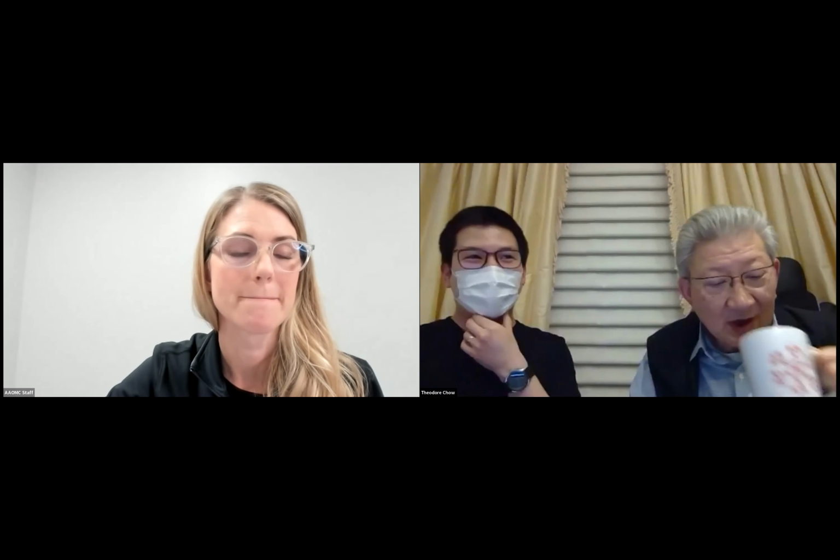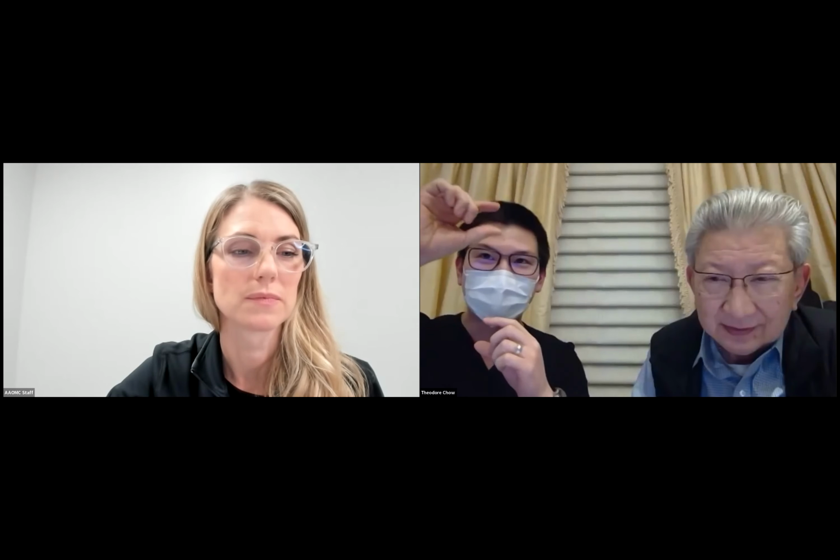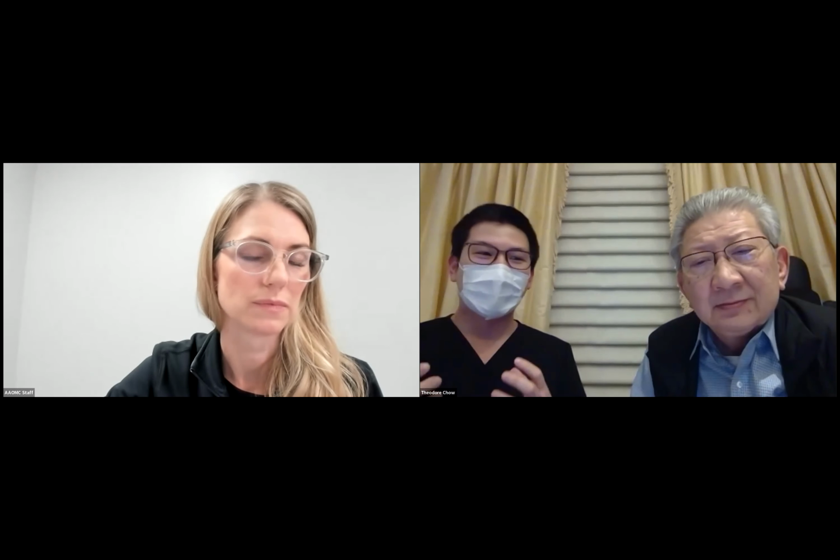When I only see a diopter still, sometimes I have to put a disclaimer: when you have the toric design fitting, I don't know how to adjust it very well after an initial lens. I might be able to adjust if it's a very significant pooling, let's say in the vertical meridian. I can steepen that up a little bit, but it gets a little bit complicated.